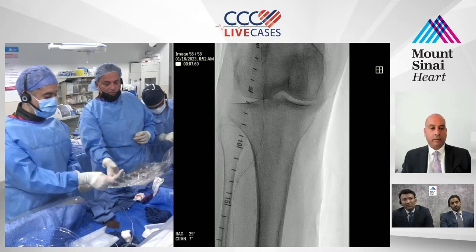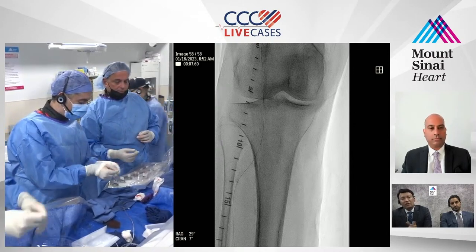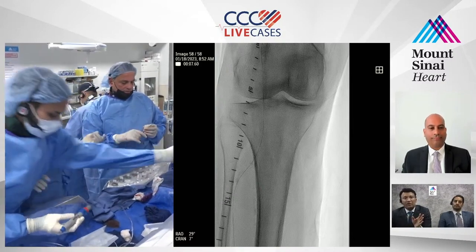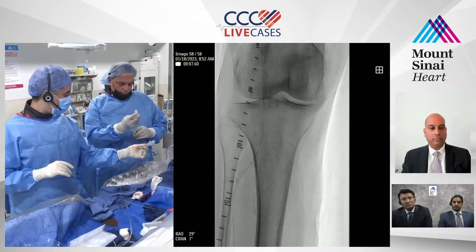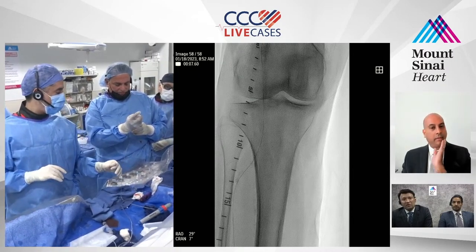Well, I don't know if a Cook sheath will be long enough to reach, guys. You got to flush it. But you can take, PK, when you put the wire down, Cook sheath is 2.4. It'll take any coronary balloon through it. Just go and balloon it. And then after that, you can take an 018 or an 014 wire and just cross. No, I'm not saying no. I'm just saying that it's going to be interesting to see the length of the sheath.